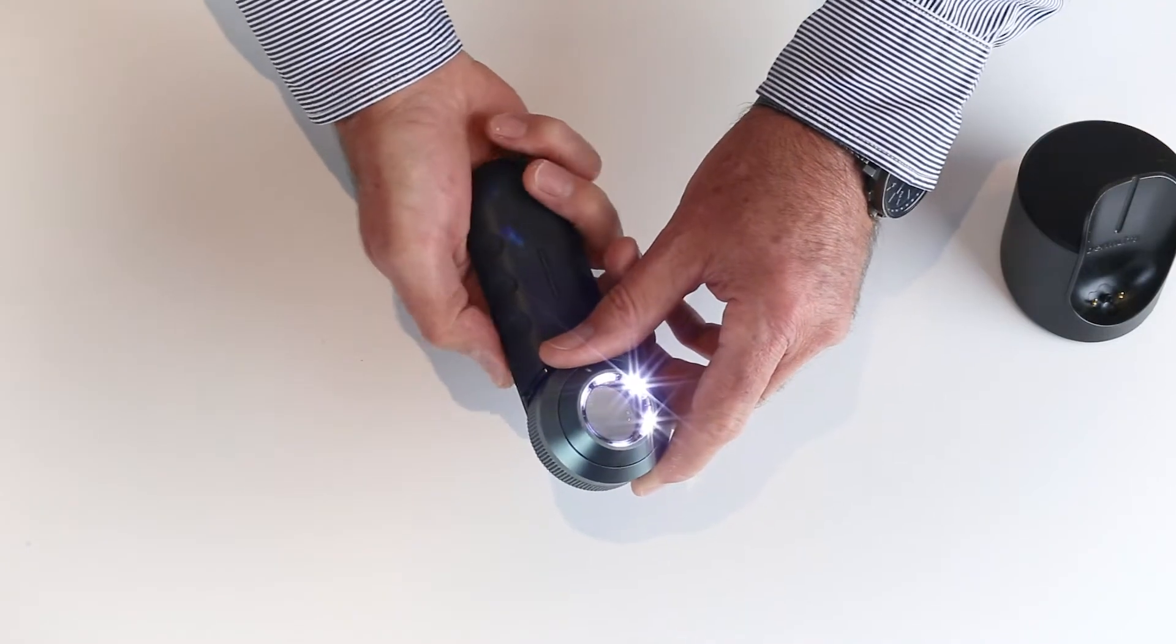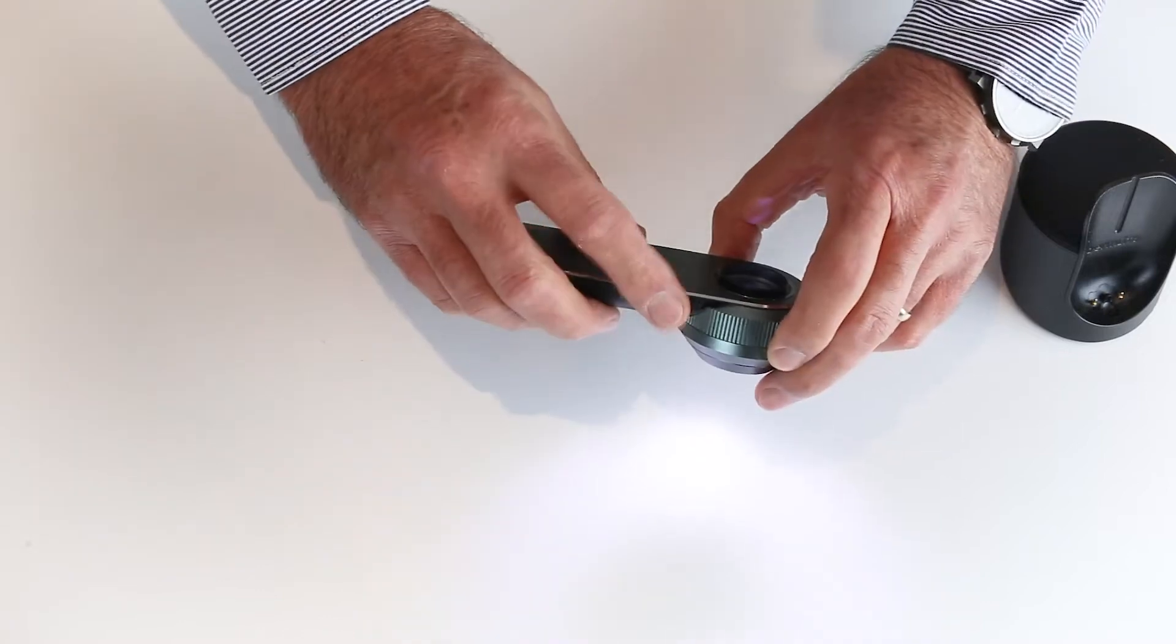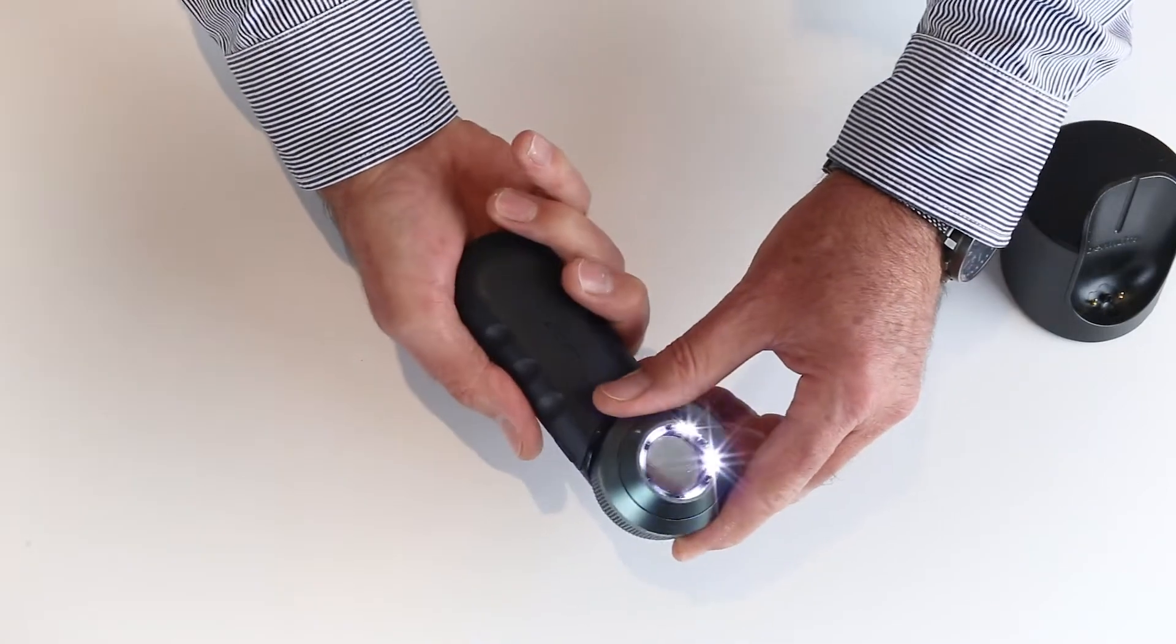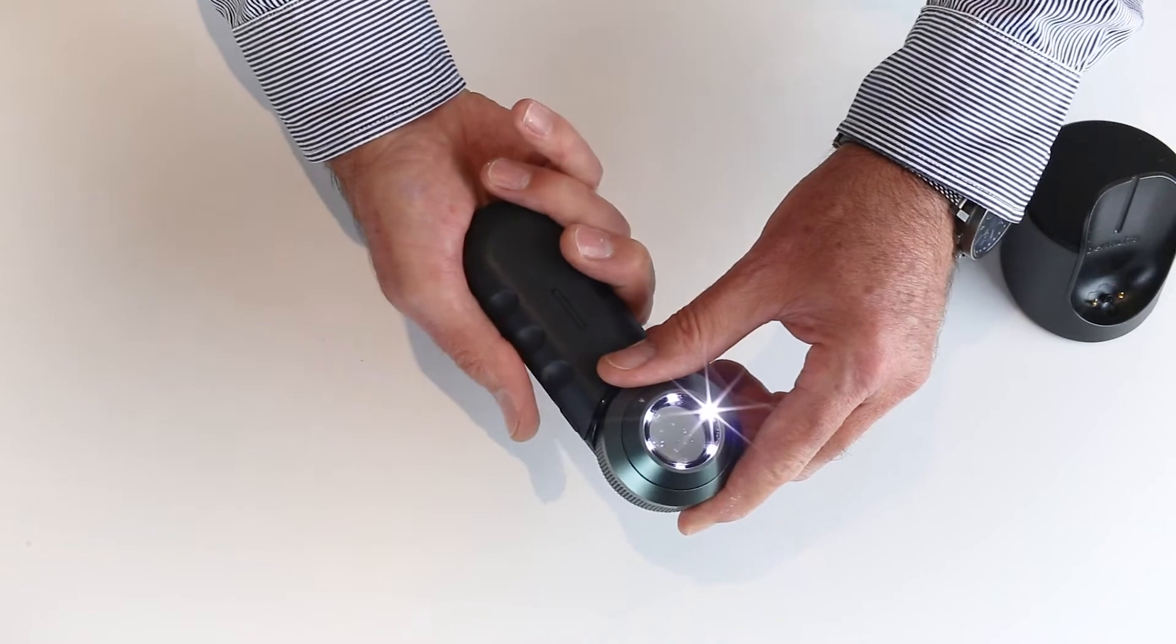By pressing the button again—the button by the way is this one here—you can toggle between polarized and non-polarized mode.